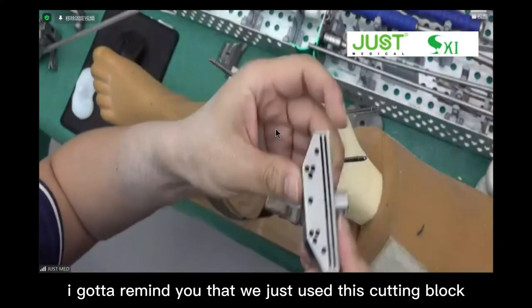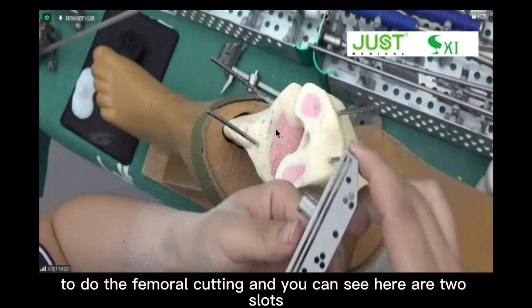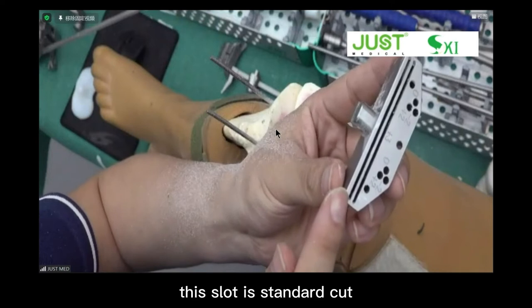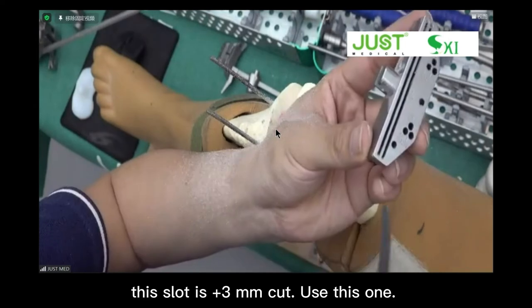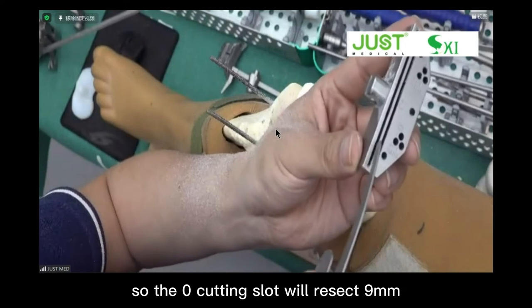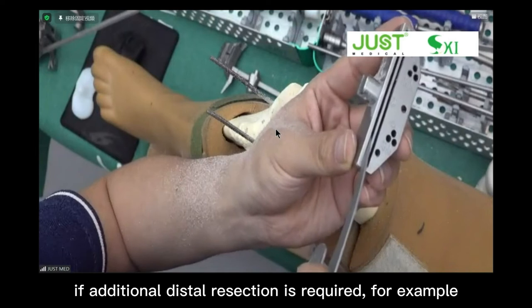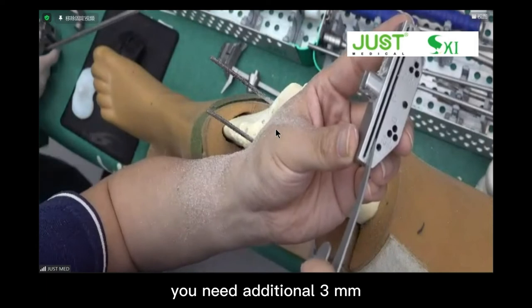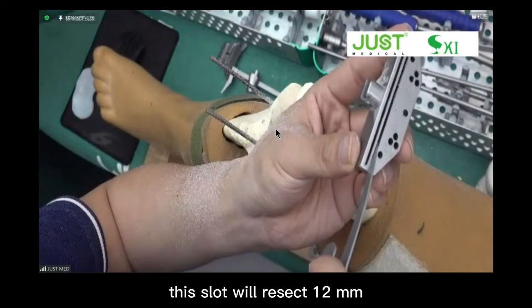I've got to remind you that we just used this cutting block to do the femoral cutting. And you can see there are two slots. This slot is the standard cut. This slot is the plus 3 millimeter cut. So the 0 cutting slot will resect the 9 millimeter. If additional distal resection is required, for example, you need an additional 3 millimeter, you just use this slot. This slot will resect at 12 millimeter.